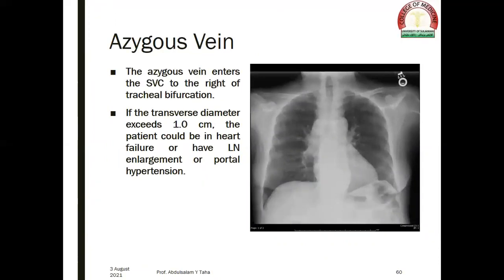The azygous vein enters the SVC to the right of the tracheal bifurcation. If the transverse diameter of the azygous vein exceeds one centimeter, the patient could be in heart failure or have lymph node enlargement or portal hypertension. This x-ray belongs to a patient with portal hypertension and an enlarged azygous vein shadow.